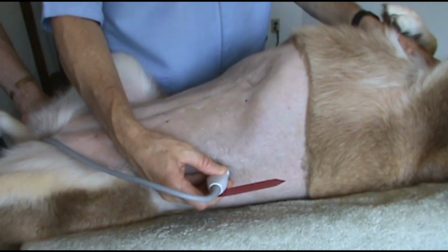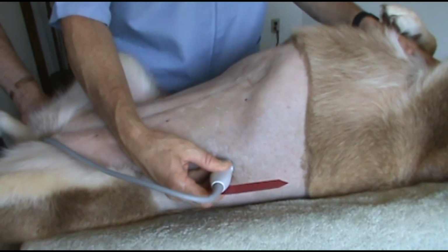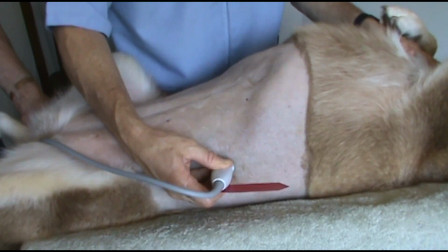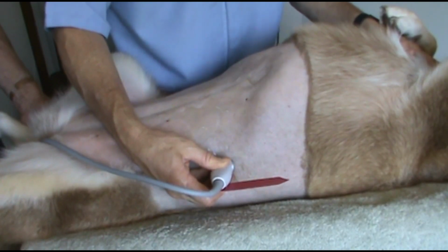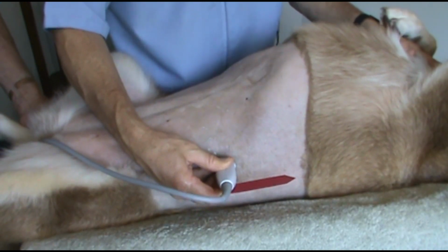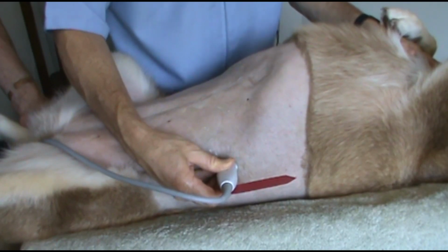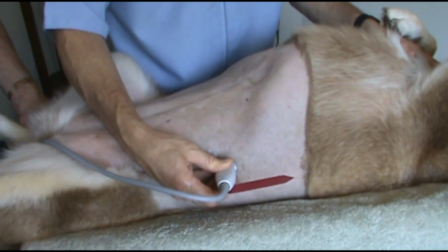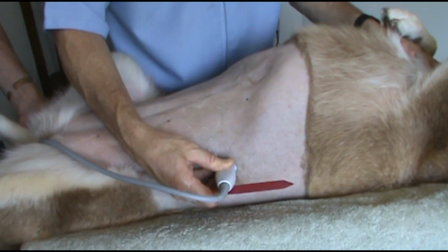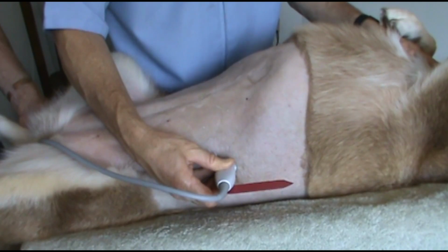It is assumed that the patient is in dorsal recumbency for the methods of finding the adrenals described. With the patient in dorsal recumbency, the abdominal organs settle into predictable locations. Abdominal anatomy and abdominal surgeries are usually taught with the animal in dorsal recumbency. Subsequently, anatomy from this patient position is familiar to most veterinarians.